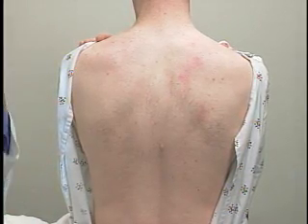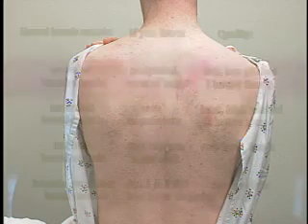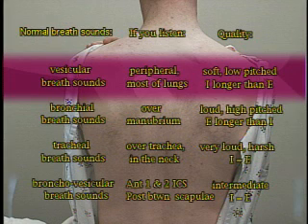When you auscultate, you're listening for breath sounds, and breath sounds are normally located at specific locations. Vesicular breath sounds are heard over most of the lung fields, peripherally. They are soft and low-pitched, and inspiration is longer than expiration.